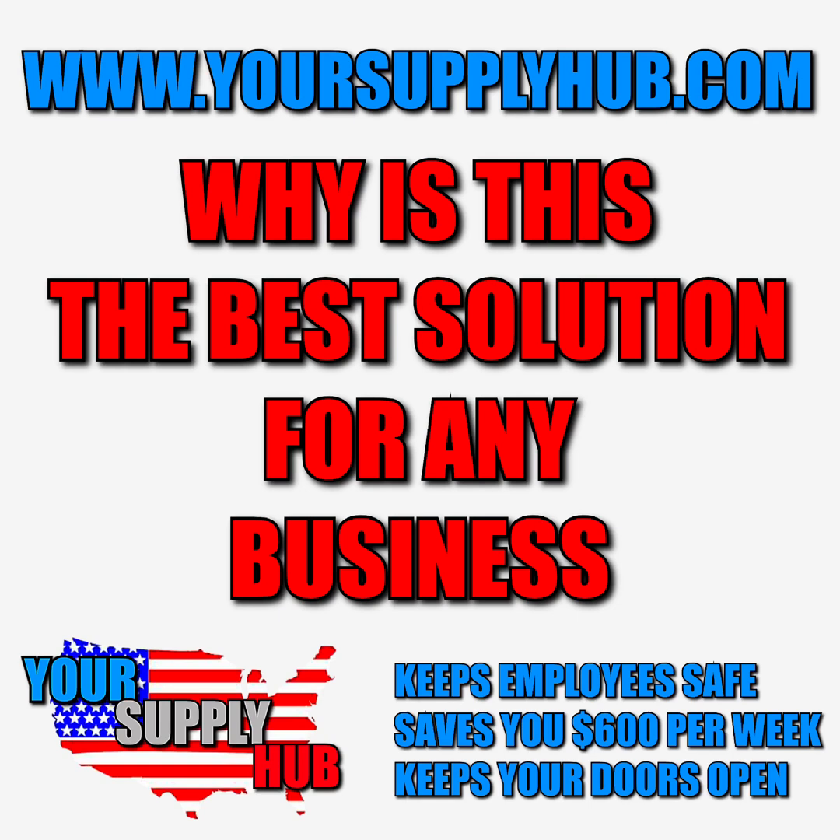This device will save you money by not paying an employee at the front door and not paying for PPE for that employee. And even if this device prevents just one sick customer from coming into your business, that one sick customer could potentially infect your entire staff, including yourself. The medical bills, lost wages, and all the headaches that come along with that — it's just not worth it. This is a simple, easy preventative measure that's at this point almost impossible to keep your business open and running without.